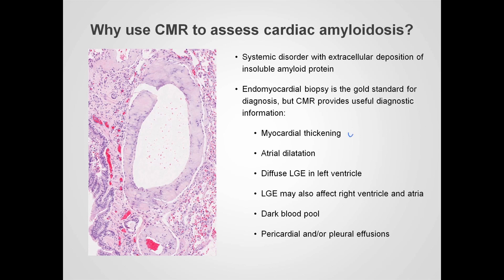CMR can identify myocardial thickening, atrial dilatation, and show evidence of diffuse late gadolinium enhancement in the left ventricle. This can also affect the right ventricle and the atria. We also see an unusual appearance of a dark blood pool during late gadolinium enhancement imaging, whereas normally the blood pool would be relatively bright. And we may see evidence of pericardial and/or pleural effusions.